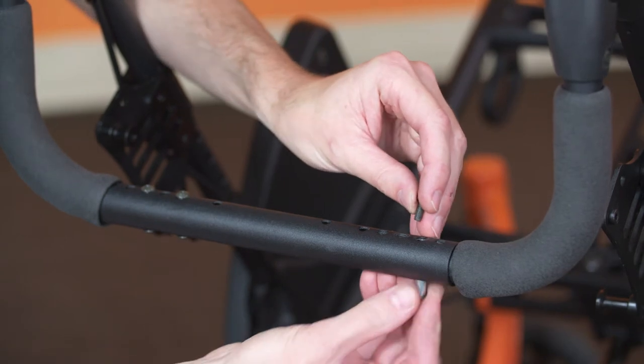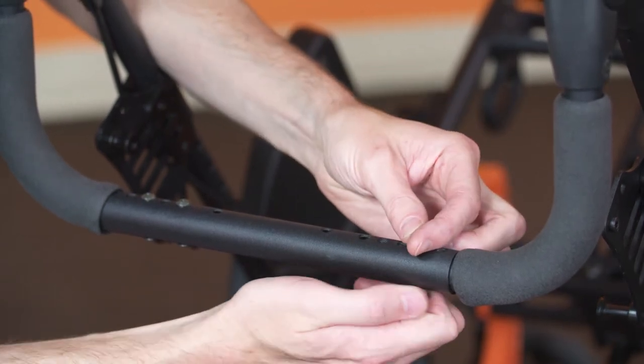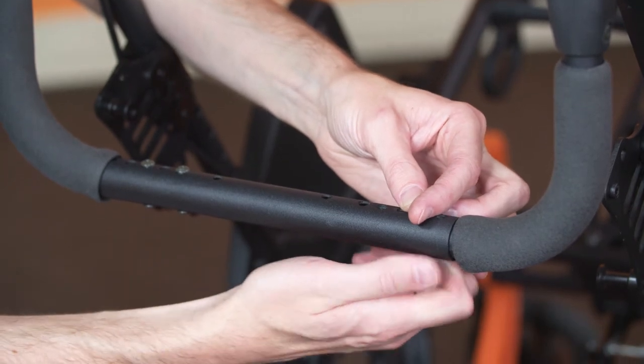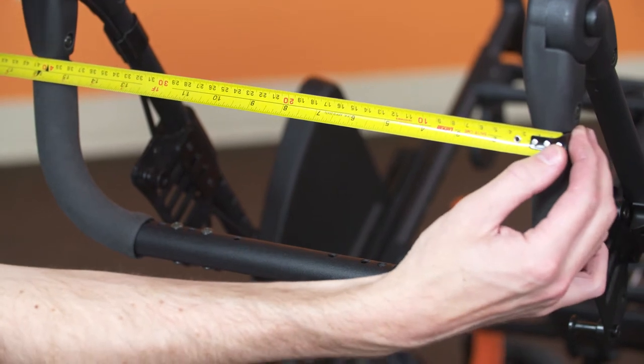If fitted, reinstall the push bar fasteners. Ensure the push bar width matches the lower backrest width.